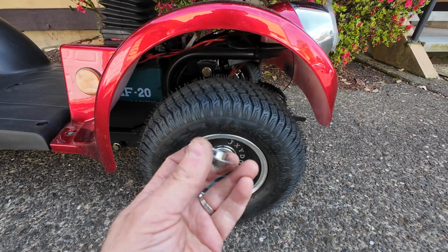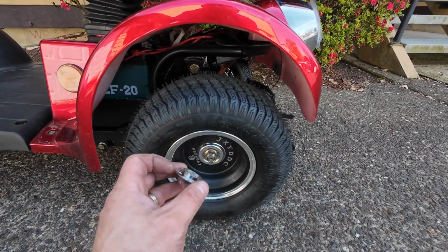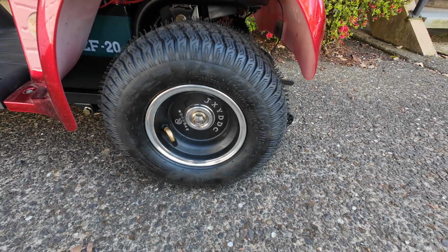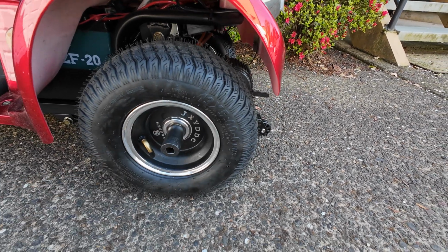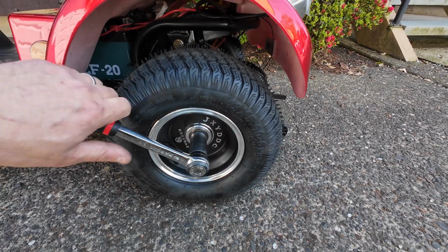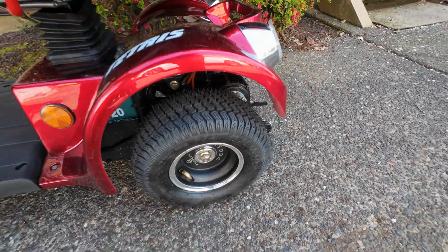Removing the rear plastic cap can be done from any position. You don't have to look for any notch or cutout. It's a different shape of plastic cap, and there is lots of room in between the rim and the actual cap. Okay, now I'm doing the same, breaking loose this nut right here, and as you can see, the rear rim is deeper than the front one. That's why you'd rather have a deep socket or extension, and just break it loose. The rest of it will go by hand.